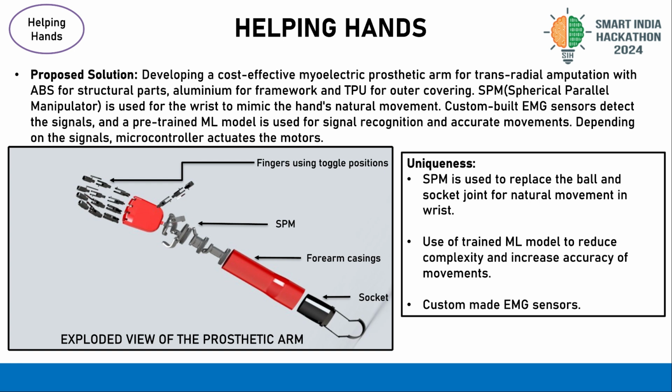The key benefits of this design include efficient energy use, natural motion, and durability. The combination of toggle-based linkage mechanism and graphical synthesis offers a cost-effective solution to creating a prosthetic hand that is both adaptable and user-friendly. It enhances mobility and gives users great autonomy, making the prosthetic hand an essential tool for improving daily life activities.